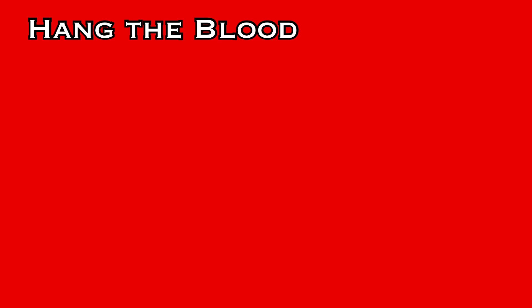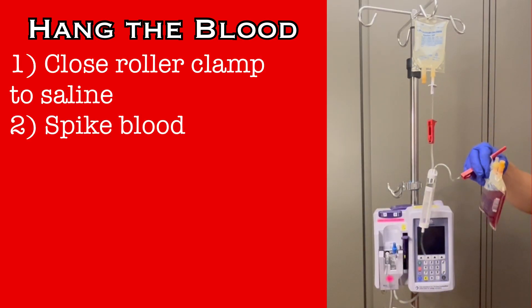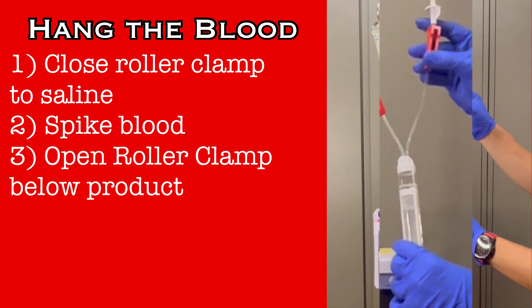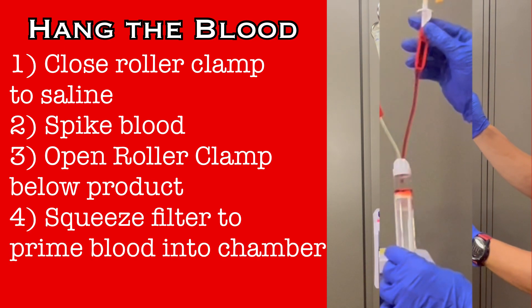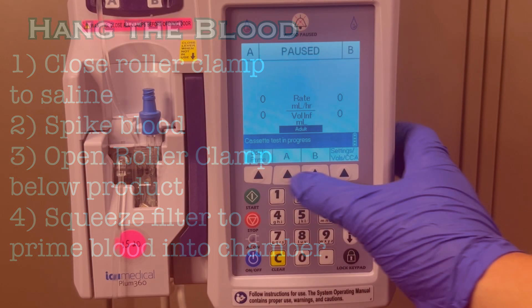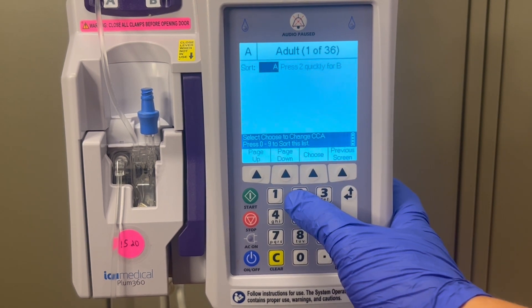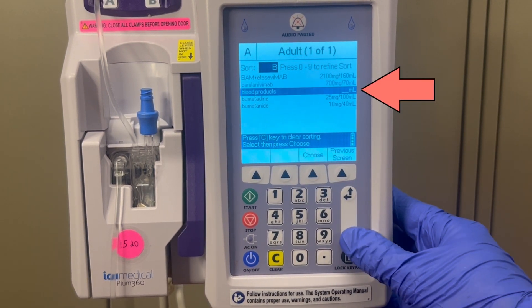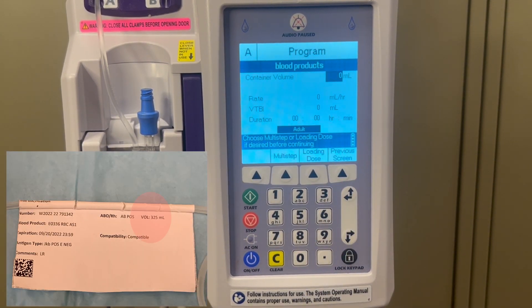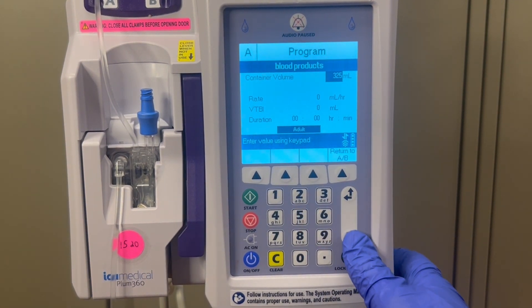Now hang the blood. Close the roller clamp leading to the saline. Use the remaining spike to access the blood product. Open the roller clamp below the product bag and squeeze the filter chamber to prime some product into the chamber. Program the infusion pump using the drug library — push the button for the A line and use the soft keys to choose blood products from the available list. You will start by entering the total volume of the bag, which can be found on the sticker attached to the blood product bag. Every unit of blood is not the same, so always verify the volume before programming.